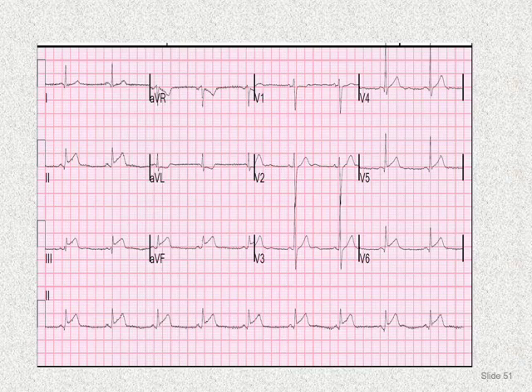So these are a few examples. I'll stress again the importance of ECG for the medical students, because they are the future doctors, and not all of them will be cardiologists, but there are several diagnoses in which time is very important. As you see, atrial fibrillation in the elderly is a precursor for stroke, a major cause of disability in the elderly population. So if you diagnose this atrial fibrillation, you will refer the patient to a cardiologist to prescribe oral anticoagulation, and you will save this patient from a future stroke.